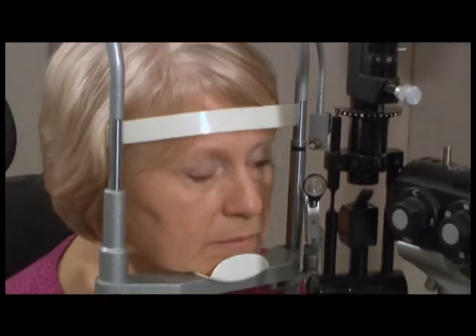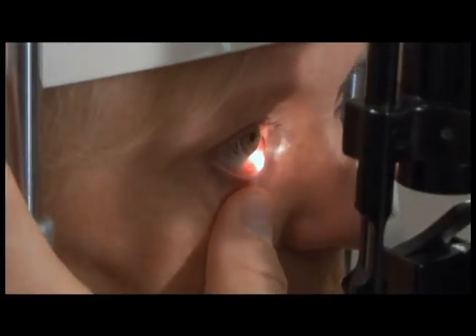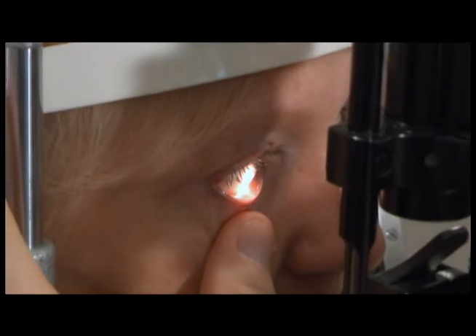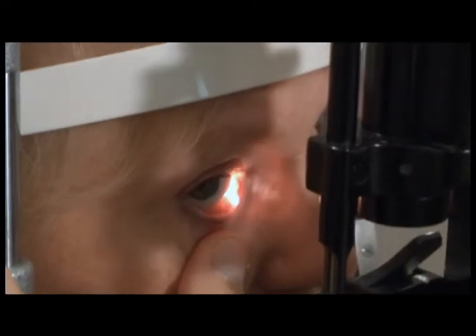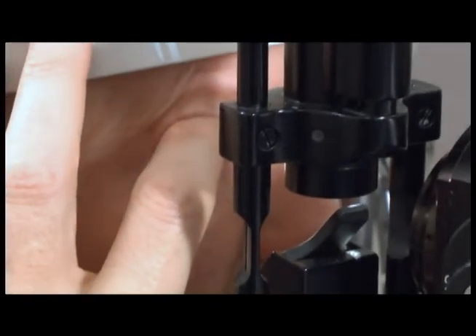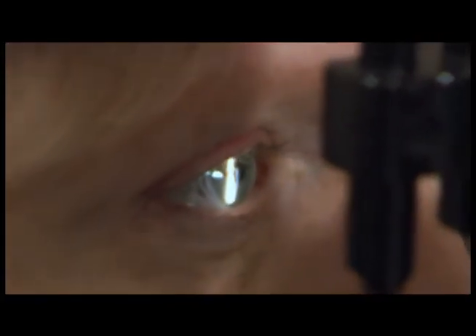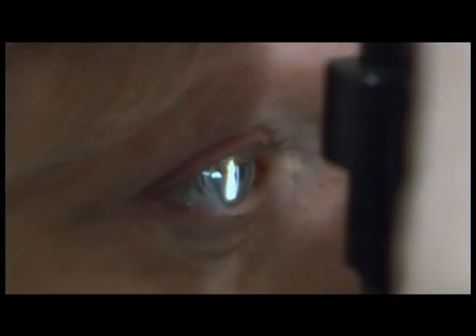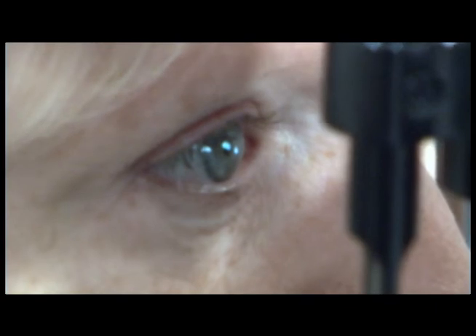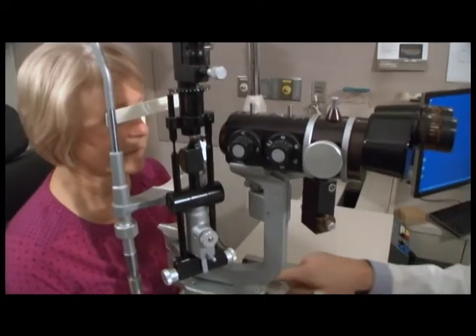Performing an exam, the inferior palpebral and bulbar conjunctiva is examined. The lateral, medial, and superior conjunctival surfaces are examined. The cornea is then examined by narrowing the beam, followed by the anterior chamber structures. At the conclusion of the exam, the screw on the side of the slit lamp should be tightened to lock the instrument into position.